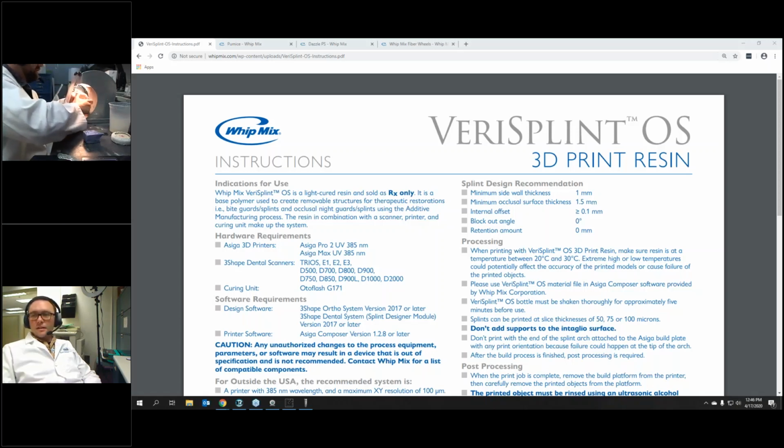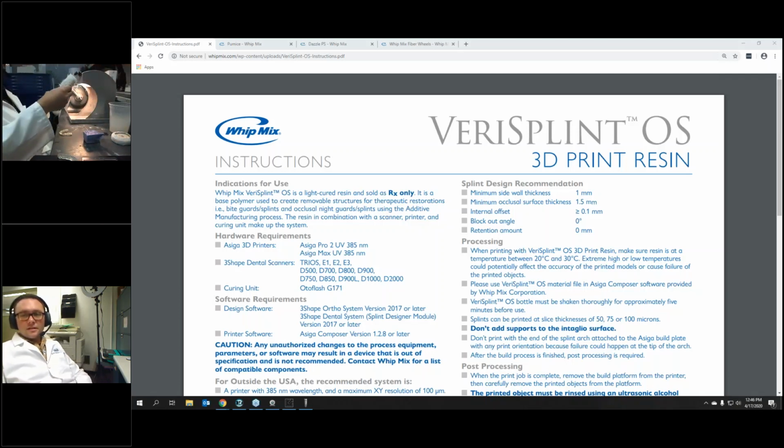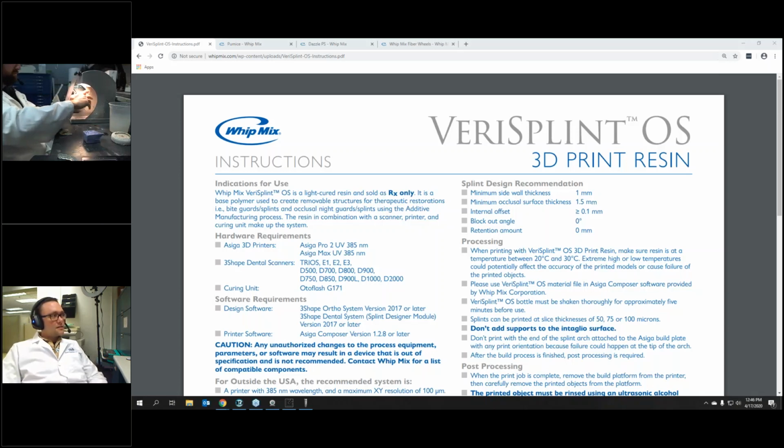While you're switching that out, Ben had a question: can you add material on the surface? Yes, you can. You can either add using the liquid resin, and what we've used is a UV flashlight to cure it, and then you do the final cure again. Or you can add regular ortho acrylic. It will stick to it. But one thing you will notice is that after you've cured the splint and then add with the ortho acrylic, there's going to be a little bit of a color mismatch because of the slight tinting you get during the curing.